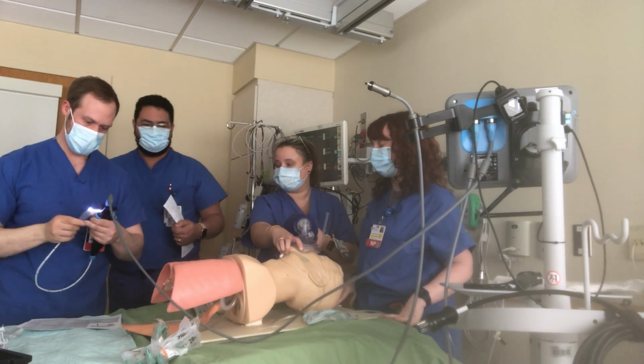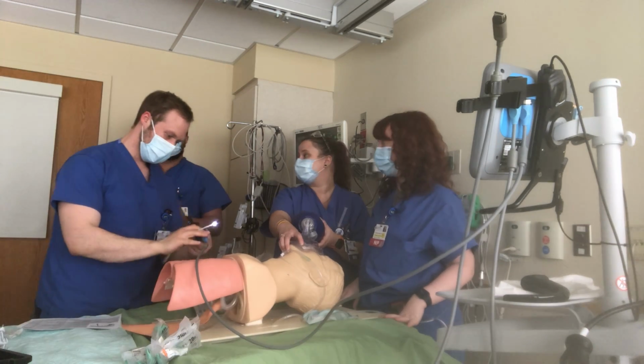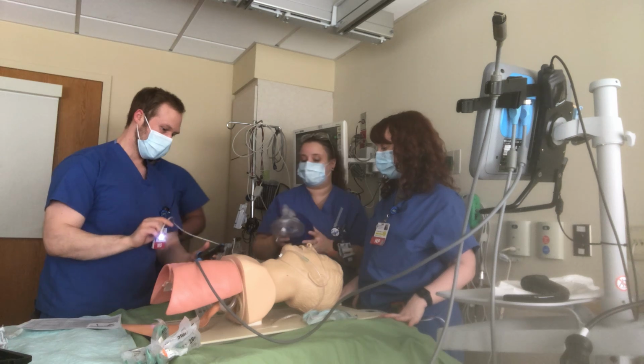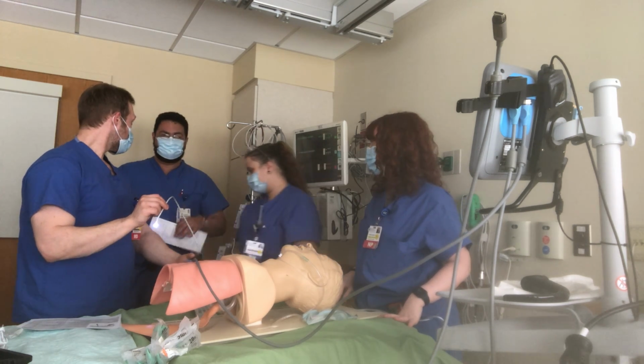Yep, there you go. Okay. So now we have the fiber optic. Okay, now what's next? You can leave the ambu bag now, right? Although this is a good training, by the way. They used to leave us for hours doing this.